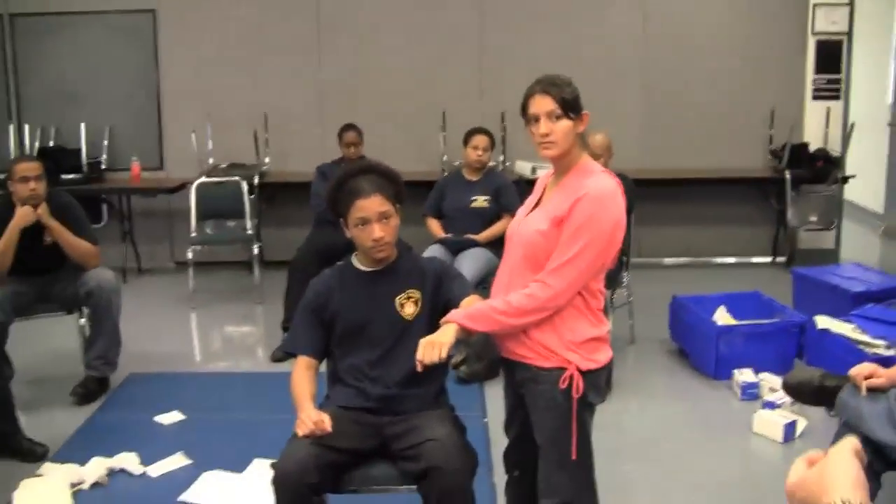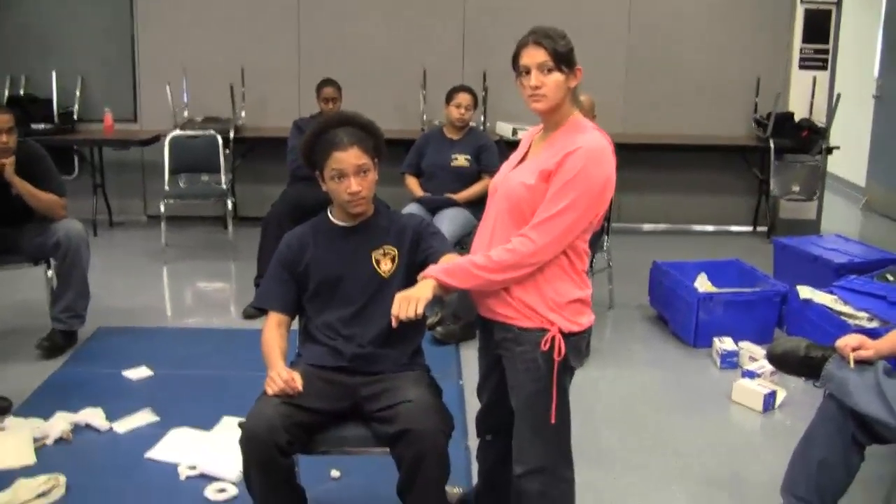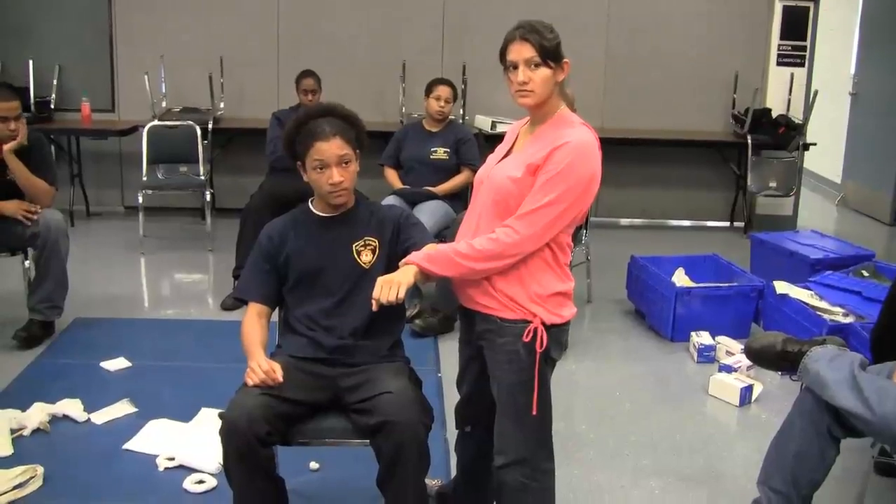Besides direct pressure, more pressure, pressure dressing, pressure point, elevation, all that stuff — we're going from direct pressure straight to a tourniquet.